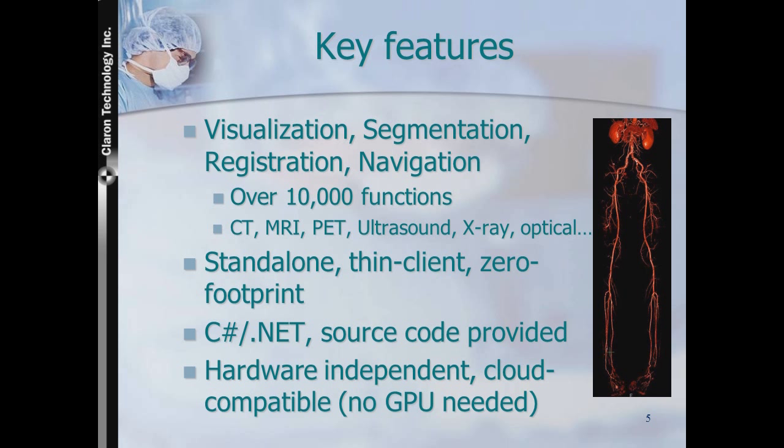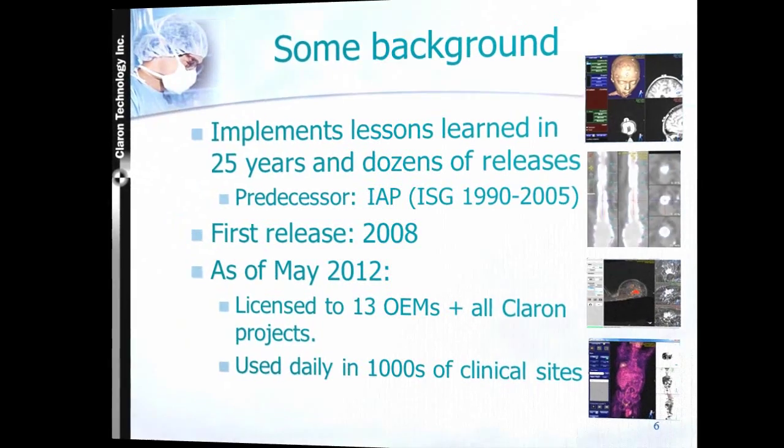WIF uses a highly optimized CPU-only raycasting volume renderer. This is in contrast to other toolkits that rely on GPU gaming cards. Working with these cards has proven a major liability. In particular, models get replaced with new ones which are not fully compatible every year or two, and GPUs cannot be virtualized for cloud-based deployment.